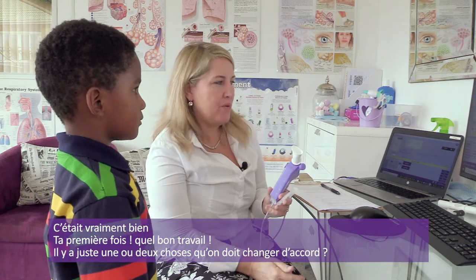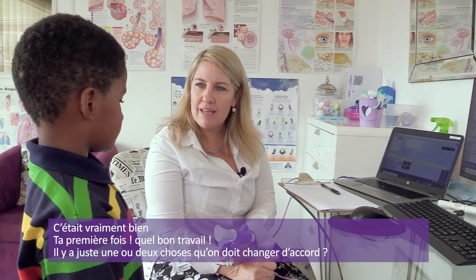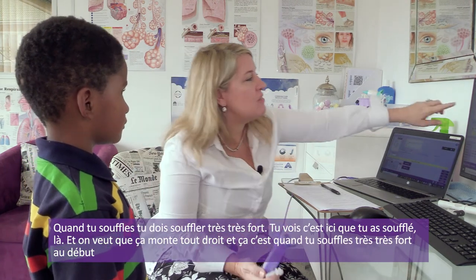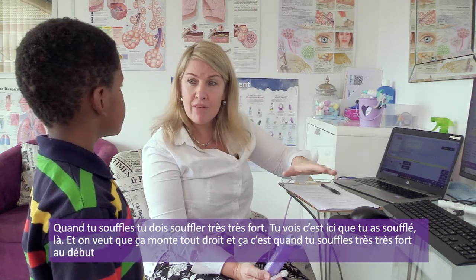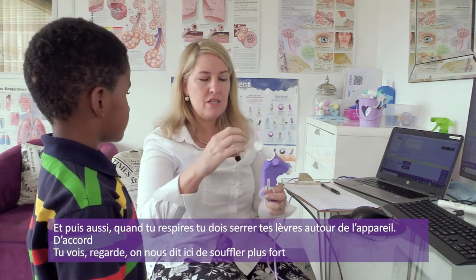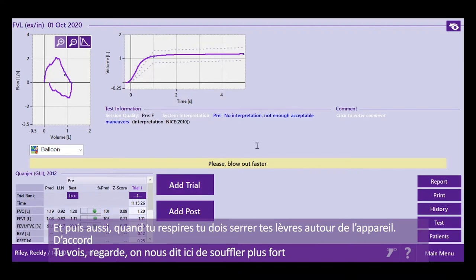Okay, so that really was good. Your first try, and you did such a good job. There's just a few things we need to do differently, Riley. So when you blow, you need to blow out very, very fast. So you see, this is your blow out here. Can you see that? We want this one to go straight up. And that happens when you blow very, very fast at the beginning of the test. Then the other thing is when you're breathing in, you need to keep your lips tightly closed onto the machine. See, look, it's telling us here, please blow out faster.